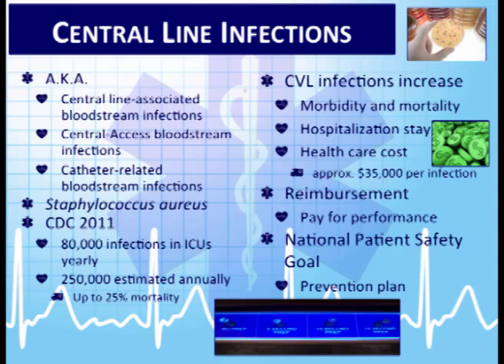So central line infections may be called central line associated bloodstream infections, central access bloodstream infections, or catheter-related bloodstream infections. Each facility might have their own wording, or the education that you get from your medical directors might call it something a little different, but it's a huge thing and it takes up a lot of healthcare dollars. So anything that we can do to prevent wasting healthcare dollars, I think, is a good thing.